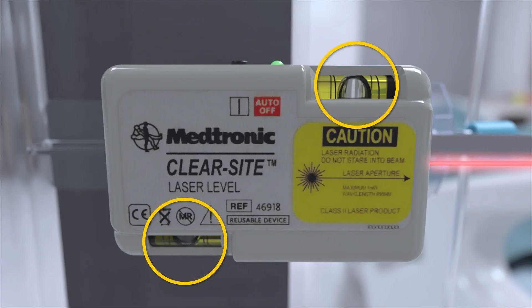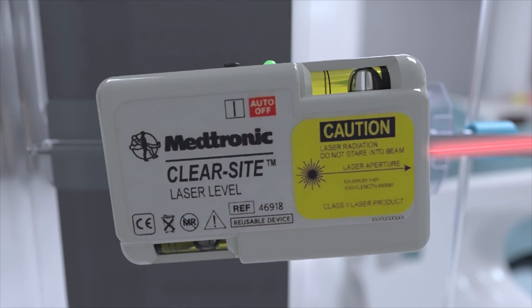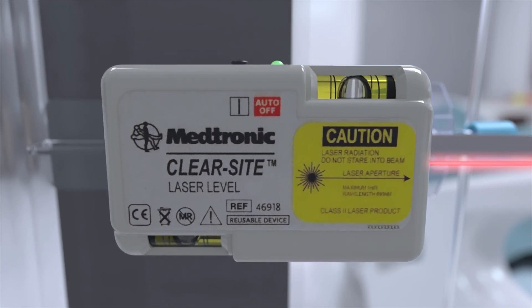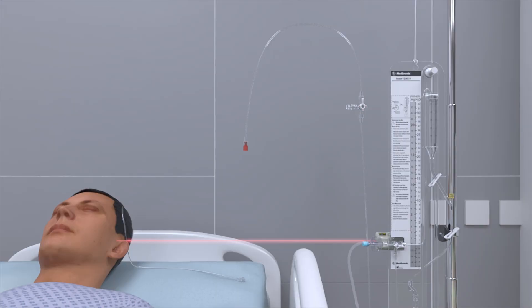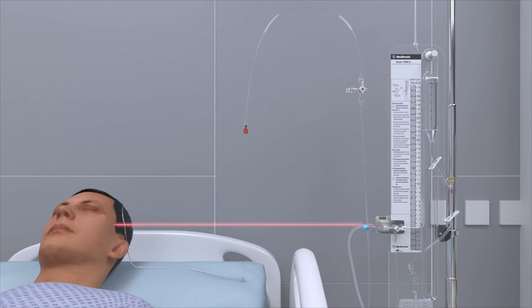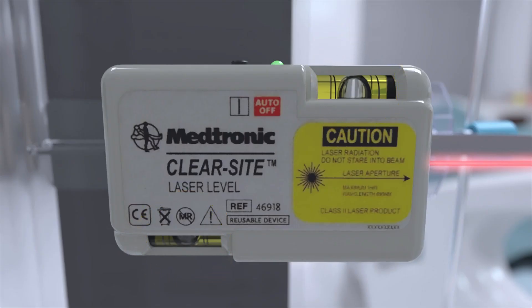Using the yellow bubble levels on the top and bottom of the laser, adjust the alignment by rotating the laser level until the bubbles rest evenly between the parallel lines. Finally, raise or lower the Becker system until the laser points to the correct landmark on the patient's body. Ensure that the yellow bubble levels are still horizontally aligned.